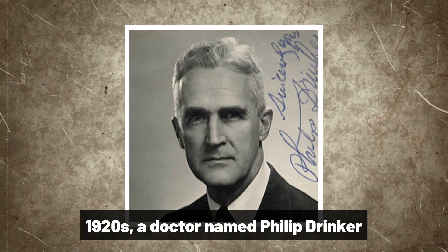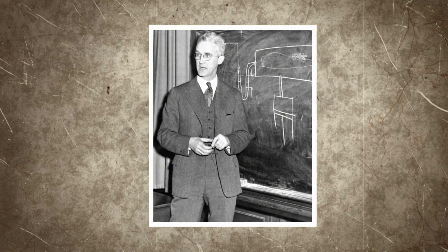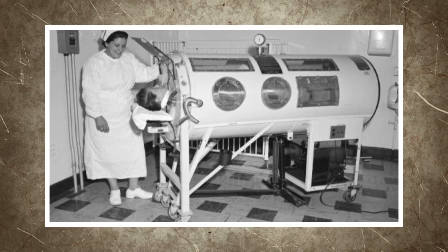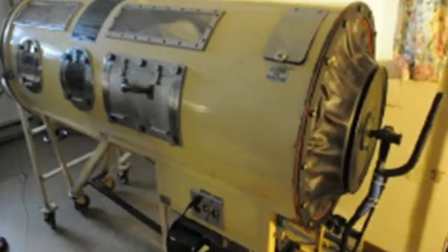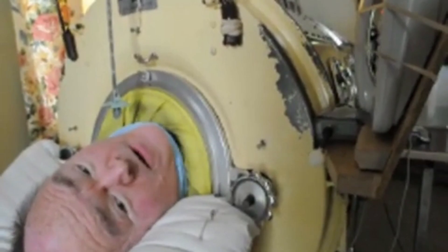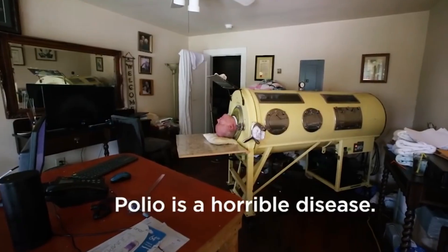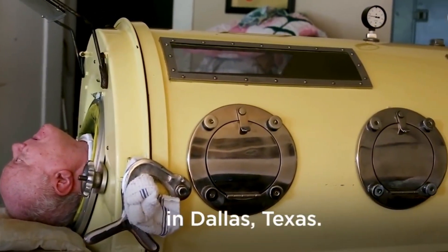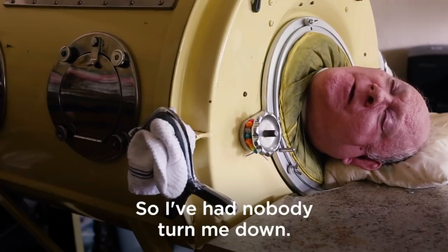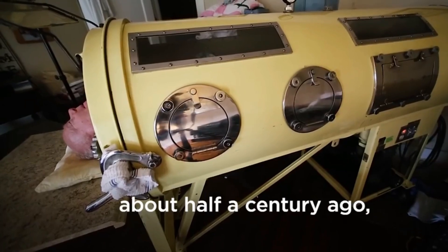Then, in the 1920s, a doctor named Philip Drinker came up with the idea of using negative pressure to help patients breathe. He and his team developed a prototype iron lung that consisted of a metal cylinder with a motorized pump that could create a vacuum inside the chamber, allowing the patient's chest to expand and contract. Over the next few decades, the design was refined and improved, and iron lungs became a common sight in hospitals and treatment centers around the world.